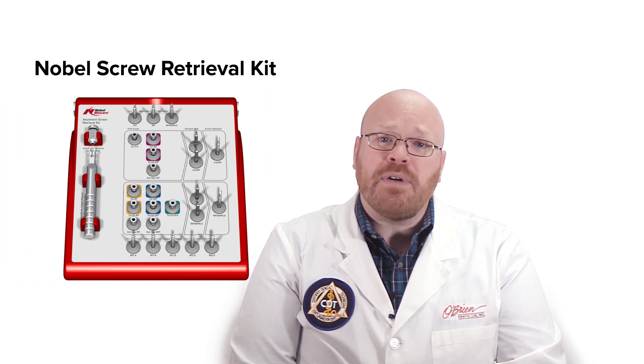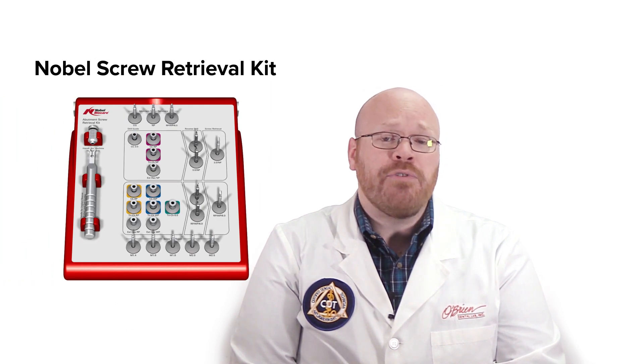There are three different kinds of tools included in this kit, and each one requires that the abutment screw has already been removed. If you do have a broken screw in the implant, you will need to use a screw retrieval kit before using one of these abutment retrieval tools.